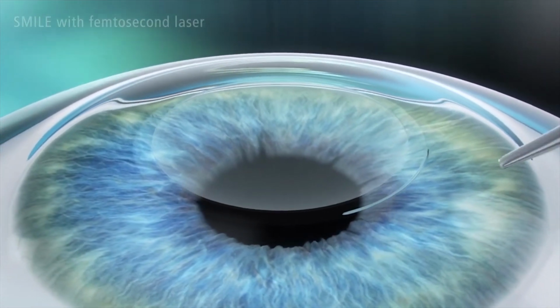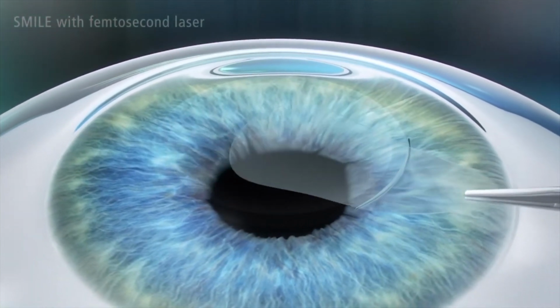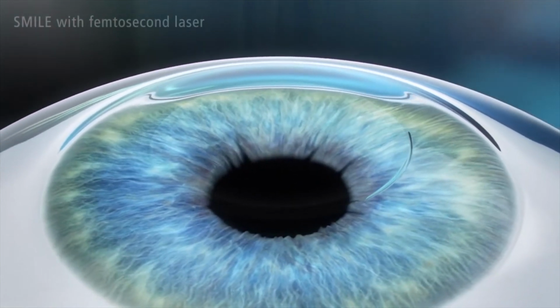And when the microscope is there, then we will apply a Q-tip with anesthetic to numb the area which we are going to hold. So when we hold there, then we can make an opening in the incision and find the anterior plane or superior plane of the disc and the plane behind. This is a very important step. Then we use a special olive tip smooth dissector without any sharp points to separate the anterior surface fully, and then the posterior surface, and then we grab the disc and take it out, and voila, you're done.